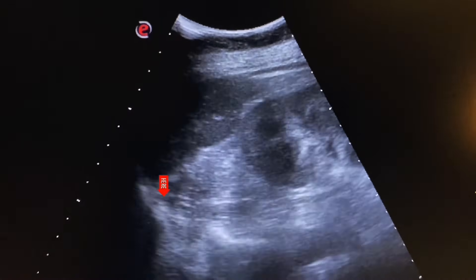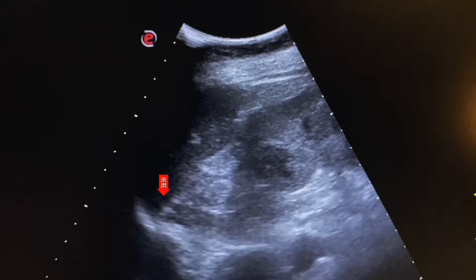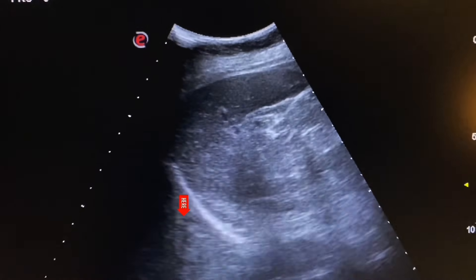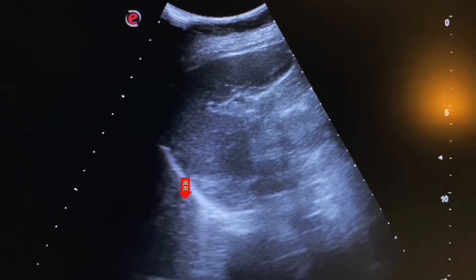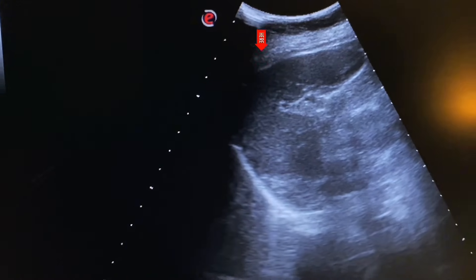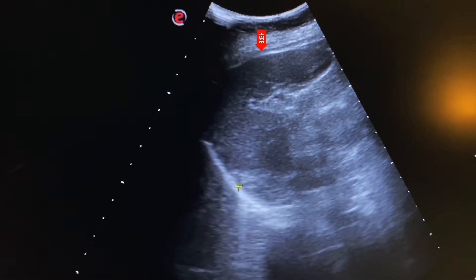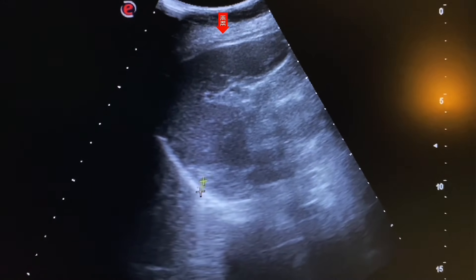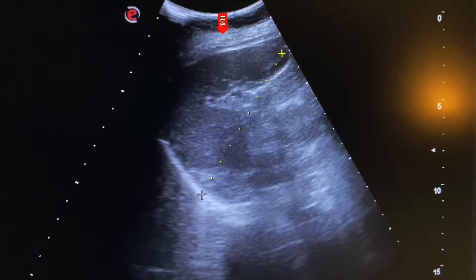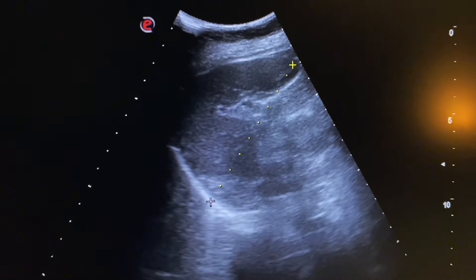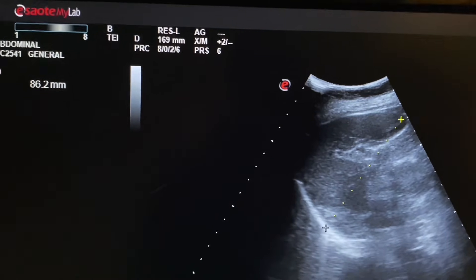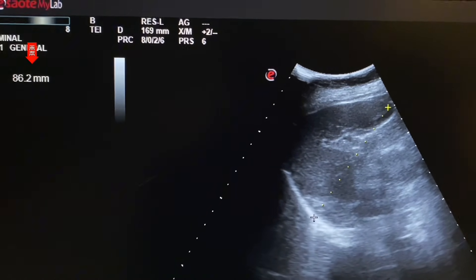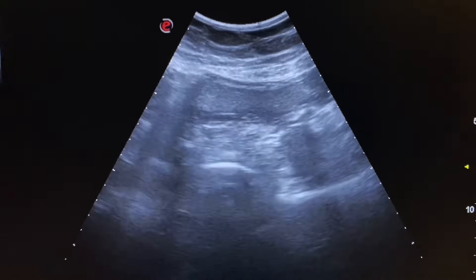This echogenic line is the diaphragm. This is the costophrenic angle of the left lung. Now we will measure the size of the spleen. For that, a craniocaudal view of the spleen is also needed. The spleen is normal in size at 86 mm or 8.6 cm. The normal size of the spleen is up to 12 cm.